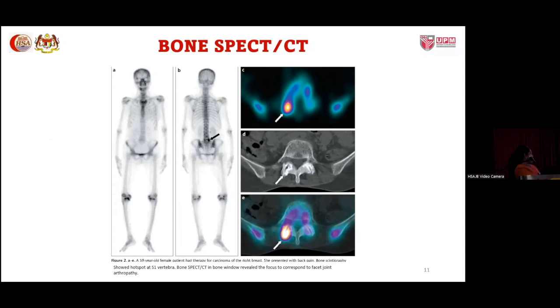So as you can see this, oh, sorry. Yeah, here. It's in the facet joint, and you can see reduced joint space, irregular joint space, some air even like a vacuum phenomenon. So all these are more in favor of degenerative changes. So we can safely say this patient does not have evidence of bone metastasis in this bone scan.